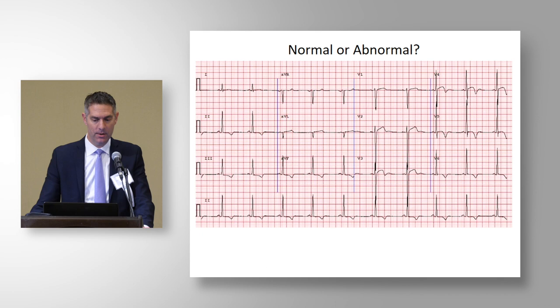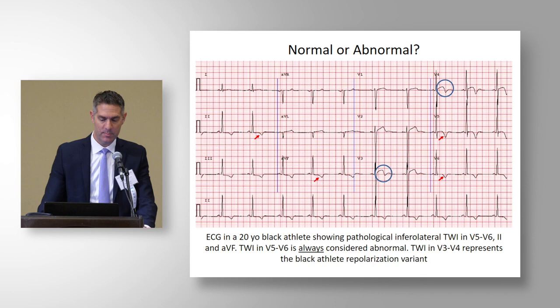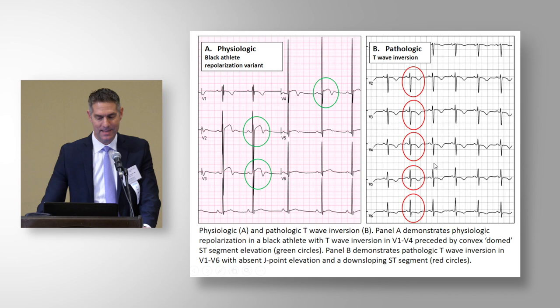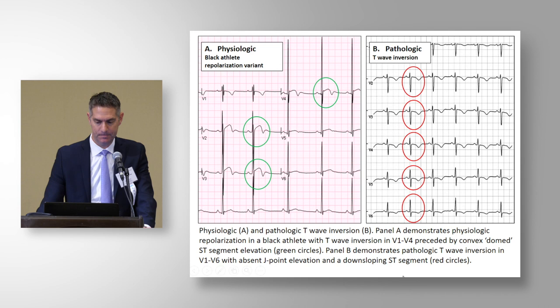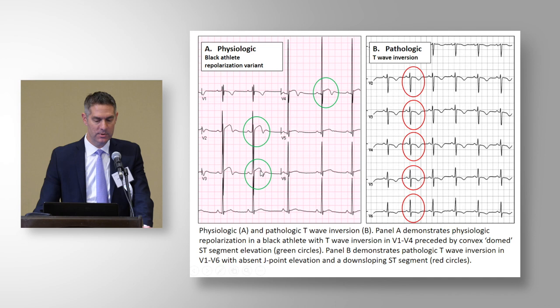When you look at this ECG, is it normal or abnormal? Pretty quickly our eyes may go to the inferolateral leads where we can see T-wave inversion that would make this abnormal. In this black athlete, there may be some normal repolarization as well as the abnormal findings. The black athlete physiologic repolarization variant is always confined to leads V1 through V4. In contrast, pathologic T-wave inversion extends beyond V4 into V5 and V6. Also, for the pathologic example, the J point and ST segment is flat or downsloping — in contrast to a J point elevation with a domed or convex ST segment.